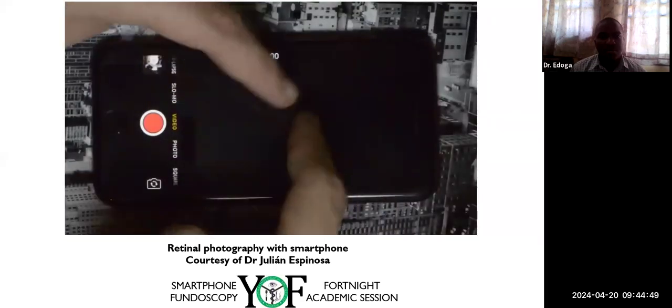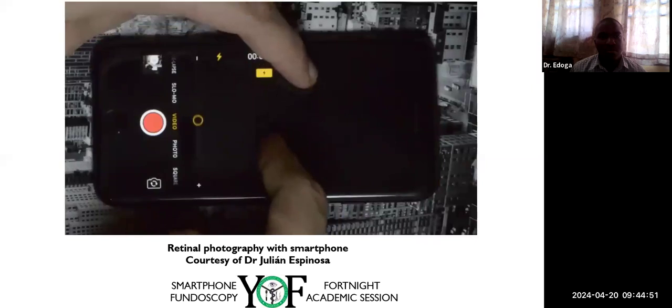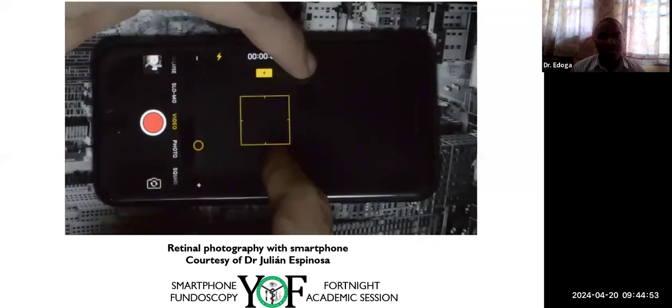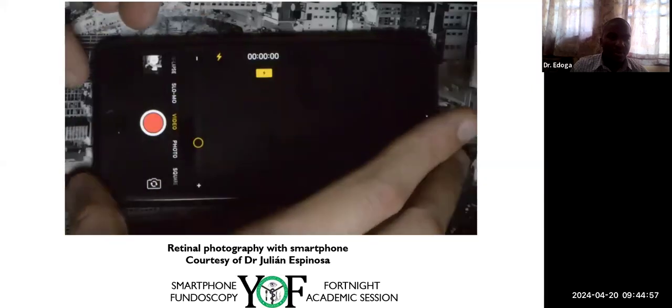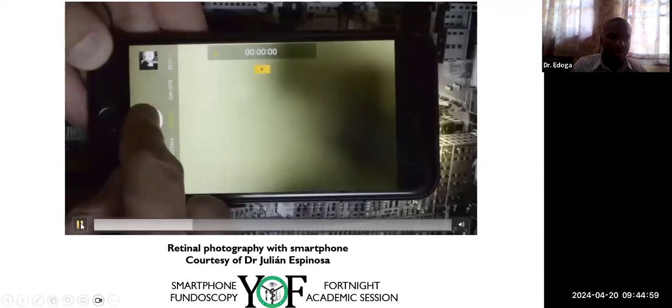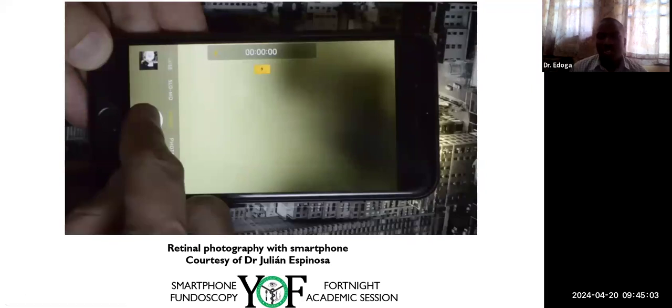Now, zoom the camera by pinching out with 2 fingers up to 3/4 of the zoom bar. This way, I've acquired the best results. Once you have an image of the retina, the reason why the camera was zoomed is so that you are going to focus on the rims of the lens.